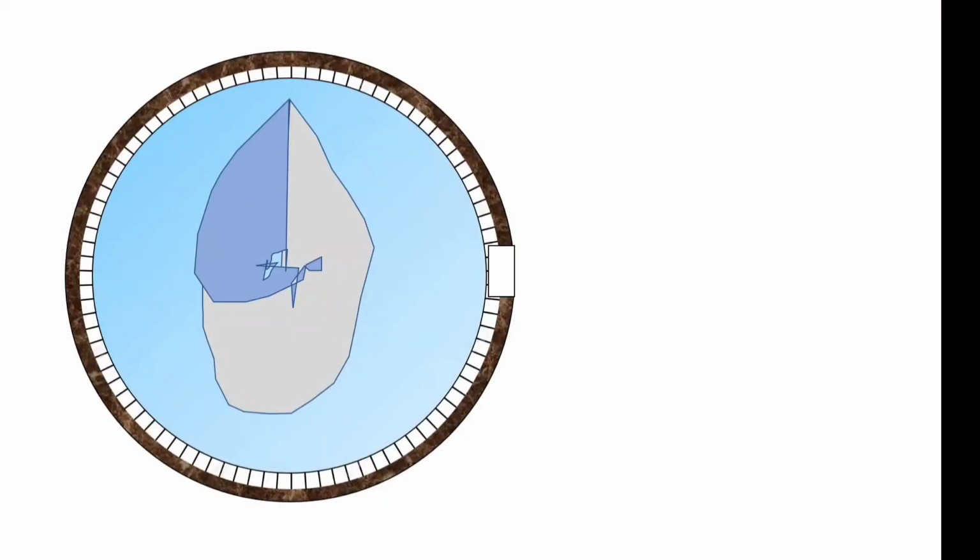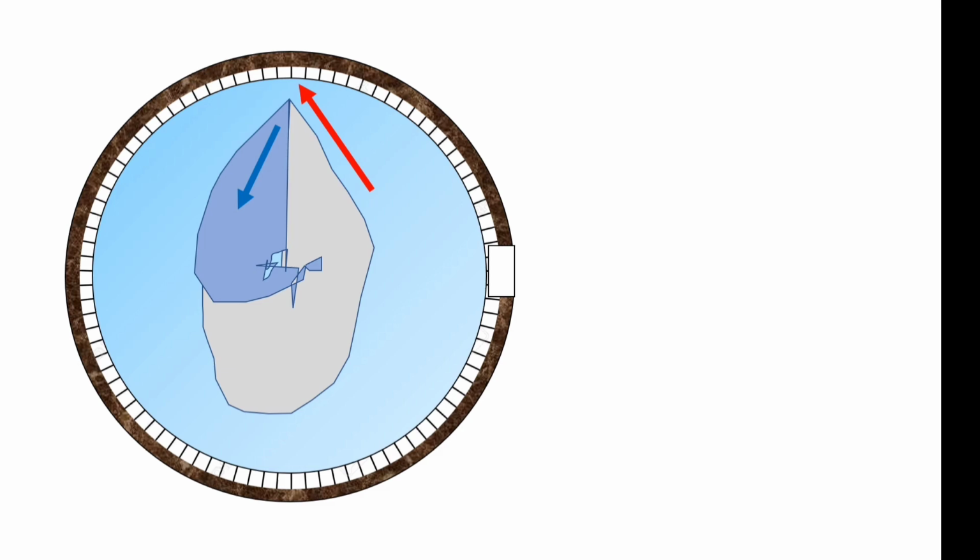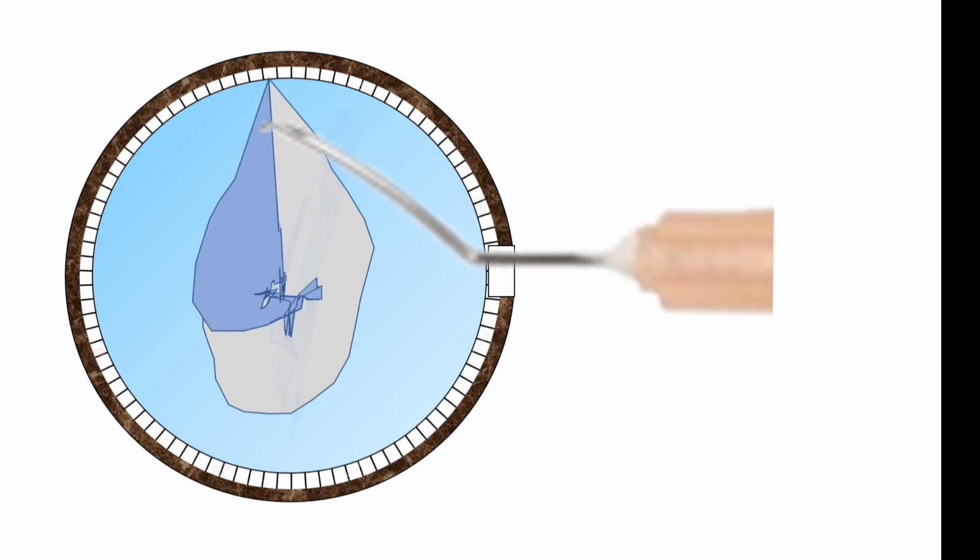So the current direction of the Rhexis is shown with this red arrow here, which is shown to be going outwards. Our immediate reaction will be to pull inwards so that the Rhexis doesn't run out, and forwards so as to propagate the tear. This blue arrow here shows our direction of pull. Now I have used a real vector calculator to see the resultant vector of these two red and blue vectors, which is shown by this black vector, and adding these two forces we see that this resultant black vector is still going outwards. This will only worsen the situation.